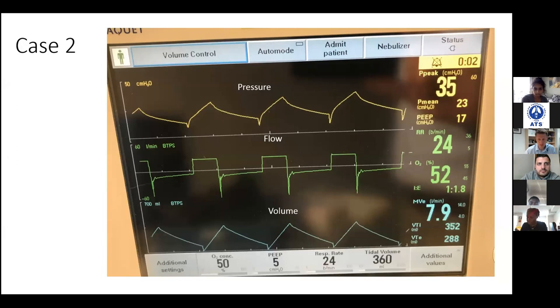All right. So I know that you already went through some of the knobology, but I think it's always worth going through again. Just to review really quick, does anyone want to tell me what the control parameter is in this ventilator? It's volume. Good. Who said that? Ahmed? Yep. How did you know that?